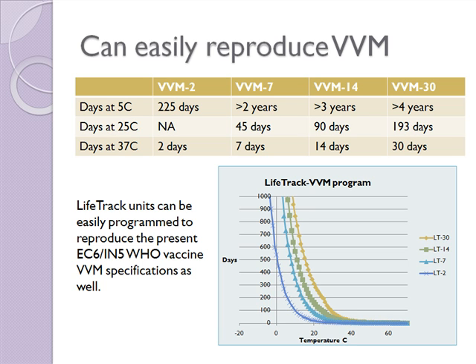We leverage the huge amount of VVM data. On the other hand, we also get more accuracy because we can accurately warn people if the vaccine has been damaged. So this might make the validation a little more straightforward or simple.